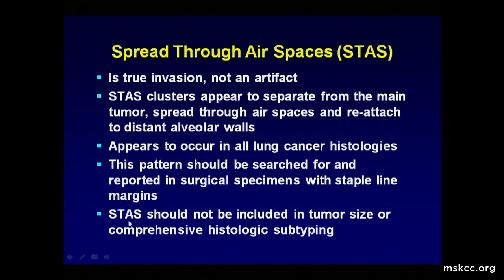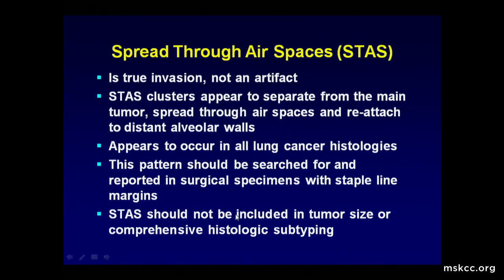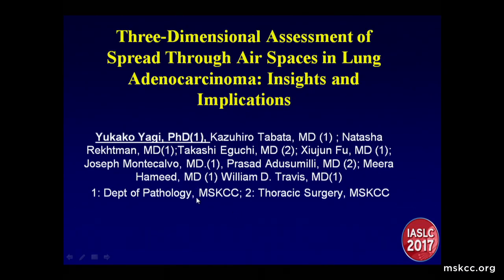And if you see it in a staple line margin, you need to tell the surgeon. And my colleagues who regard this as an artifact, I look them square in the eye and say, are you going to confidently tell the surgeon where there's STAS in a margin that the margin is benign? And I told them I don't think that's a good idea. We also don't include this in tumor size or comprehensive histologic subtyping.